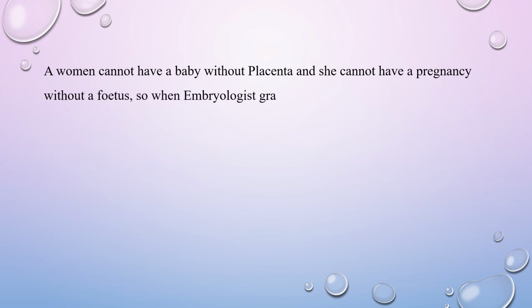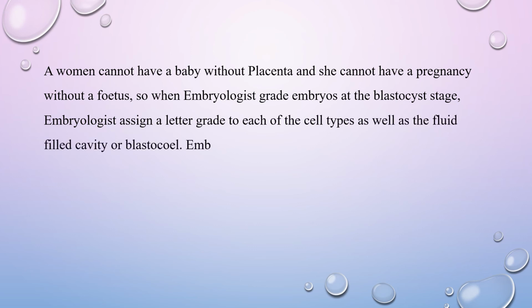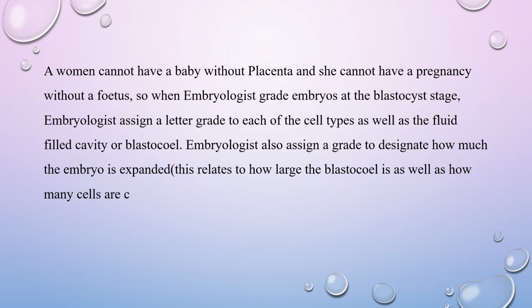So when embryologists grade embryos at the blastocyst stage, they assign a letter grade to each of the cell types as well as the fluid-filled cavity, or blastocoel. Embryologists also assign a grade to designate how much the embryo is expanded. This relates to how large the blastocoel is as well as how many cells are contained in the embryo.